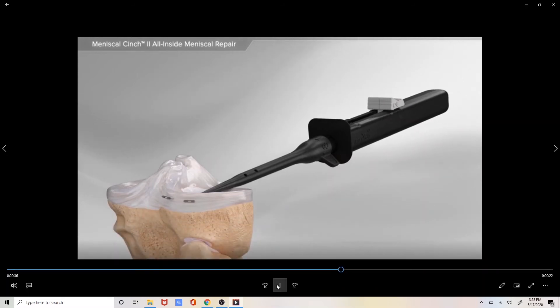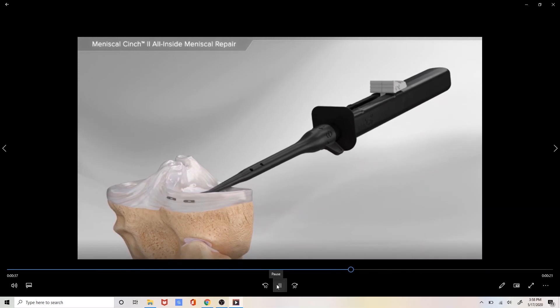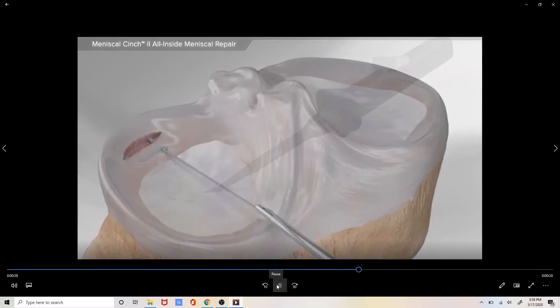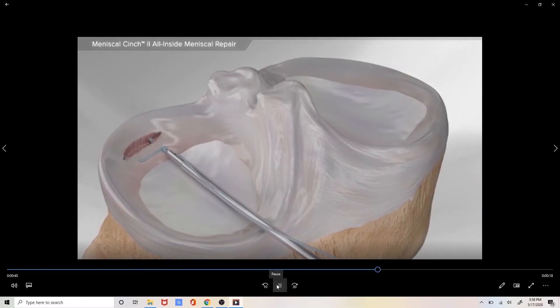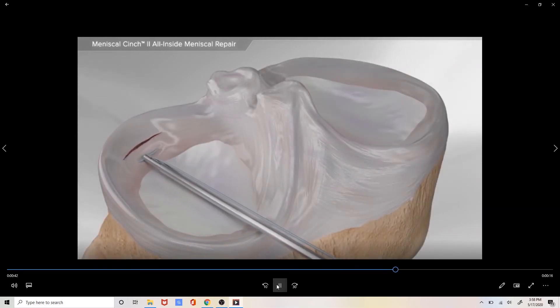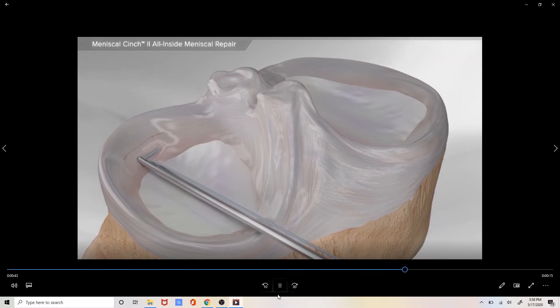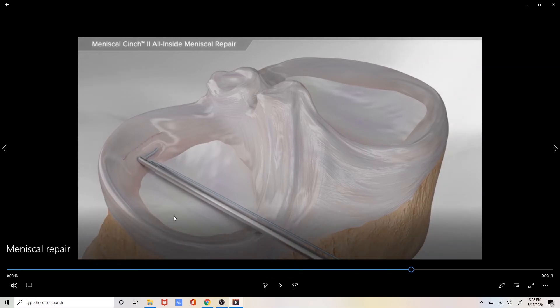The device can then be removed and the suture is then tightened from the front. As the suture is tightened it brings the two surfaces of the meniscus together completing the repair.